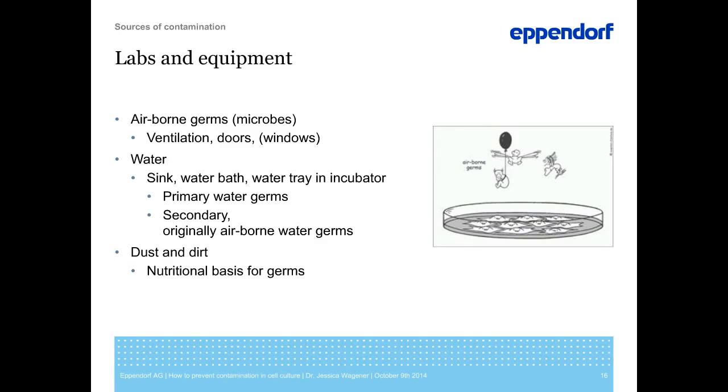The next source for contamination is dust and dirt, which is a nutritional base for germs. So the more dust you have, the more ground you have for potential contamination.